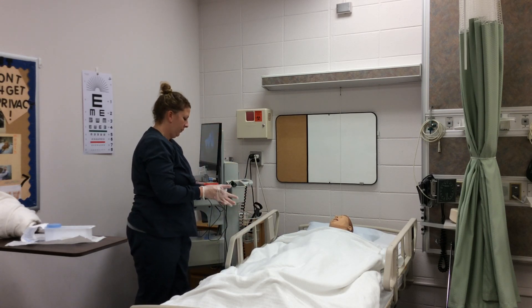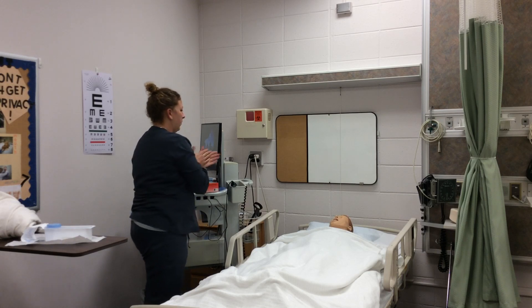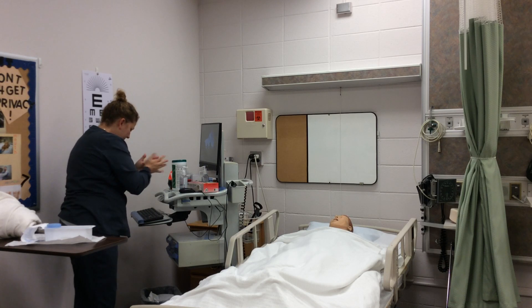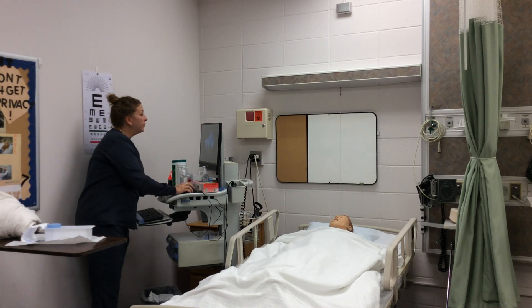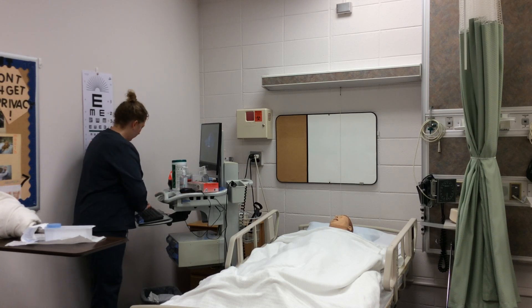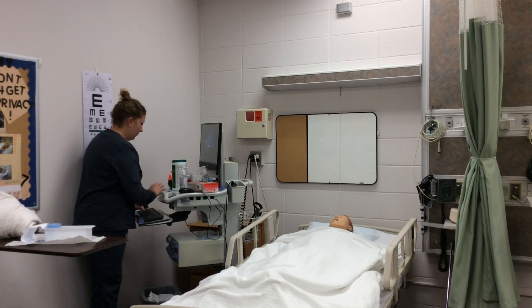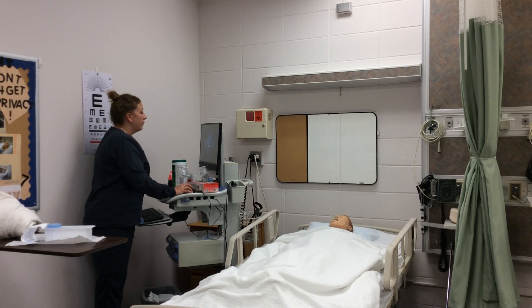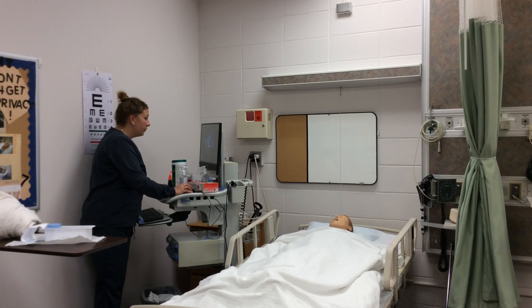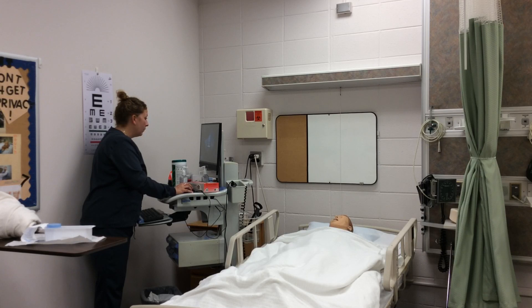She removes her gloves and performs hand hygiene. She then proceeds to document: the date and time of catheterization, the type of catheter used, the initial urinary output, urine quality, quantity, odor, whether a specimen was sent to the lab, the patient's alertness and orientation, abdominal assessment, and response to care. Throughout the procedure, Sarah maintained safety and professional demeanor and language.